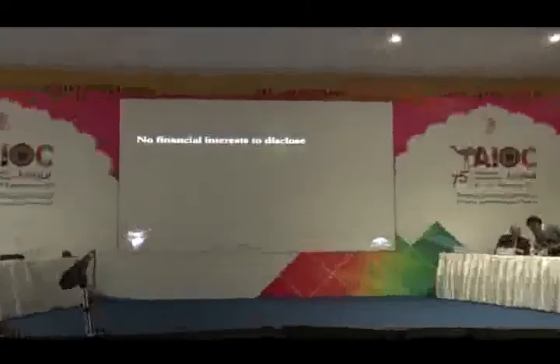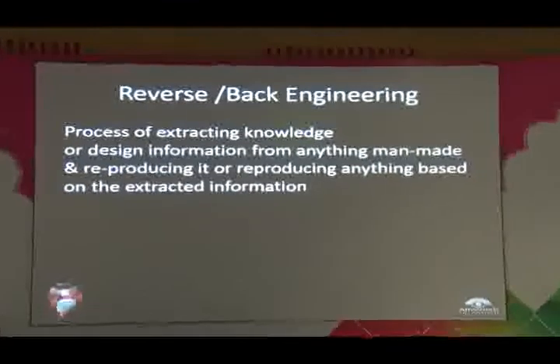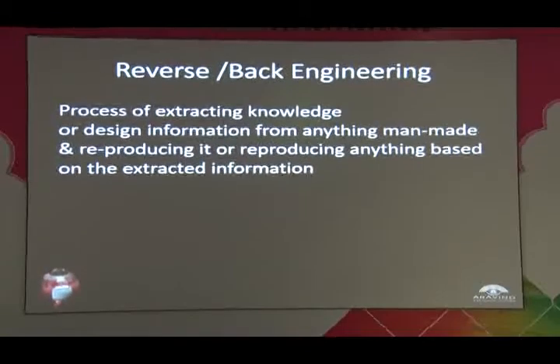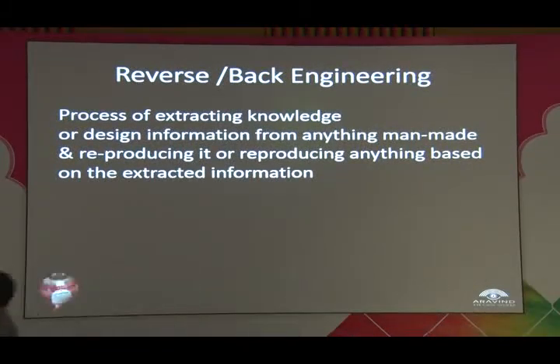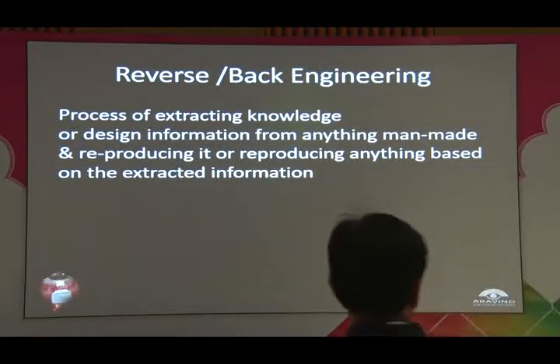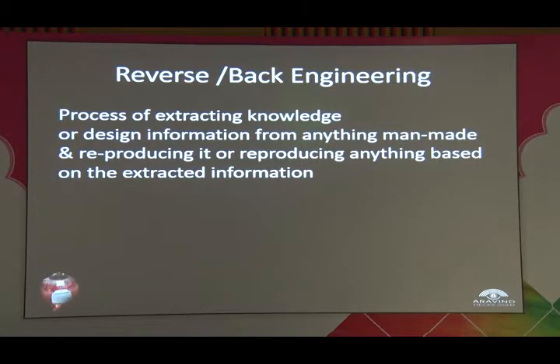Of course, management of intractable glaucoma is one of the challenging problems in the field of ophthalmology. One of the best options is the glaucoma drainage implant device, which has become more popular for the past two decades. But one of the disadvantages, especially in countries like ours, is the cost factor, which is very expensive, and the common man cannot afford it. That's why we at Aravind Hospital, with the help of biomedical engineering of our lab, thought of manufacturing a cost-effective drainage implant for intractable cases of glaucoma.